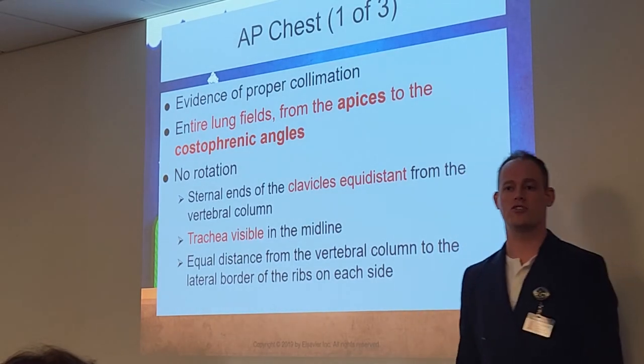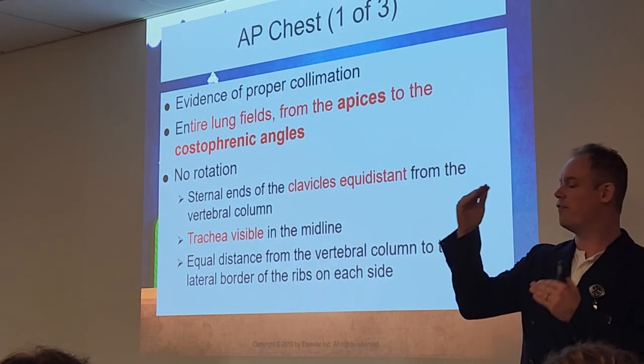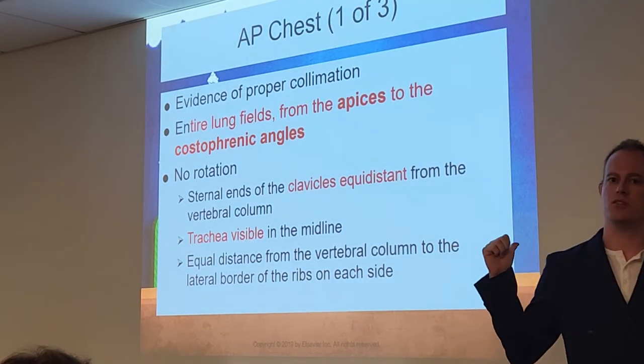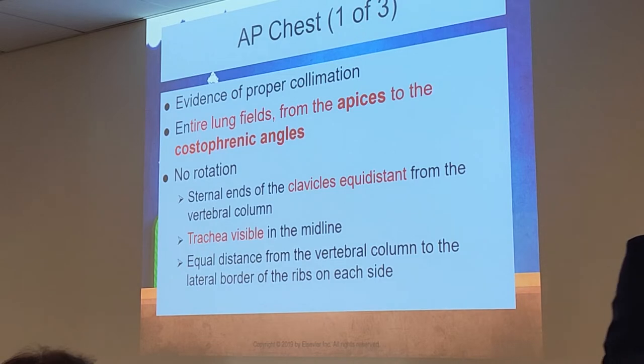It's a little harder on portables because you have a free cassette. You're actually putting a free cassette behind the patient instead of sending them up against an actual bucky, like you guys have been doing in lab. So that can be a little bit more difficult, but we always want to do our walk around to make sure they're nice and centered, nice and flat, and as centered as possible considering their condition.